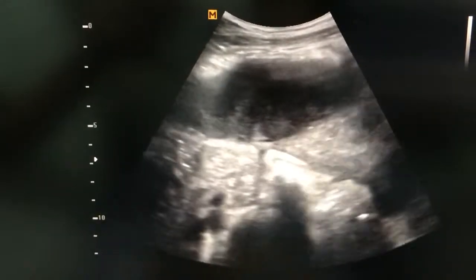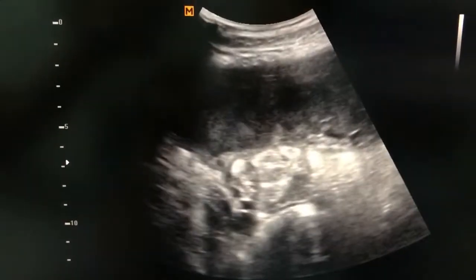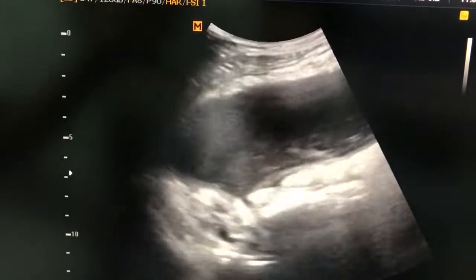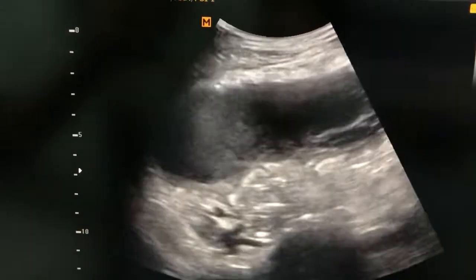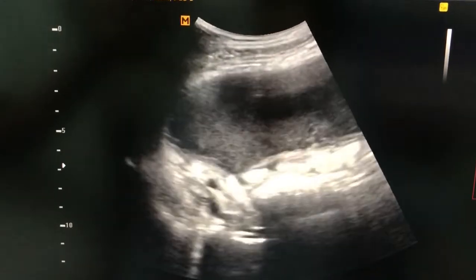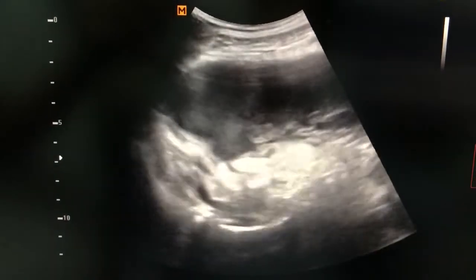This could be an endometriotic cyst which might have gone under torsion, or it could be a simple cyst also, but we cannot predict what kind of cyst this might be. But especially this video is to focus on the texture of the internal fluid which is present in the cyst.